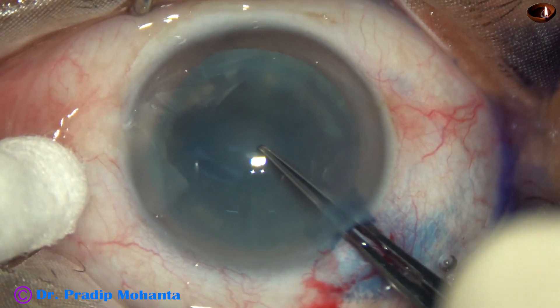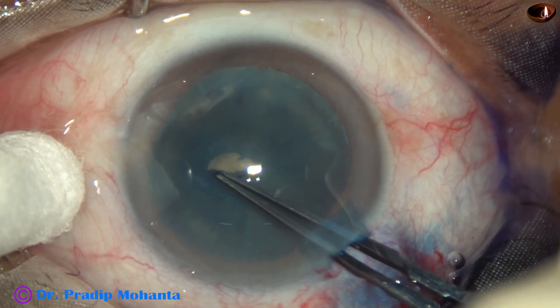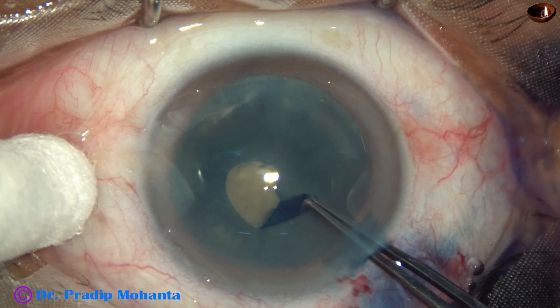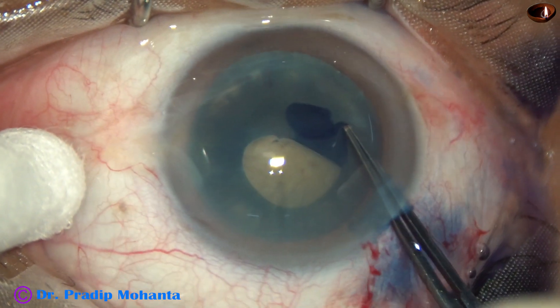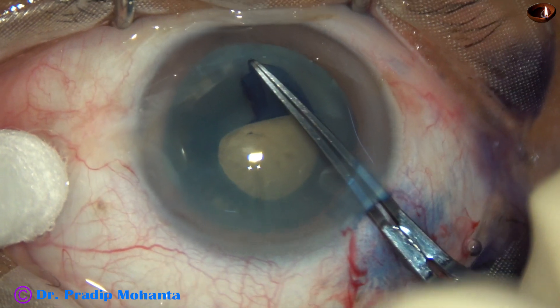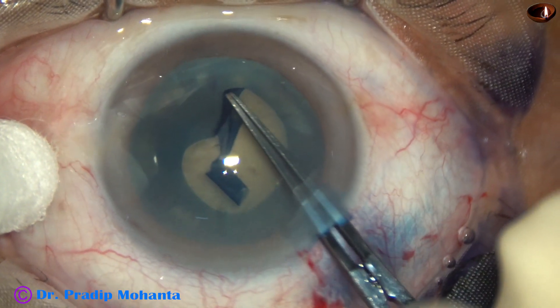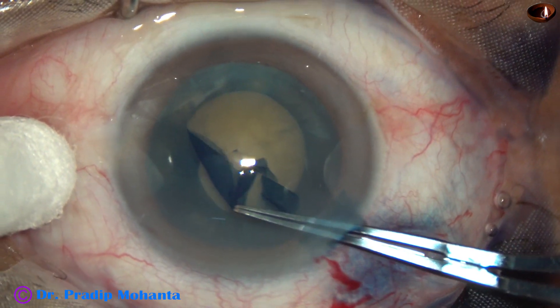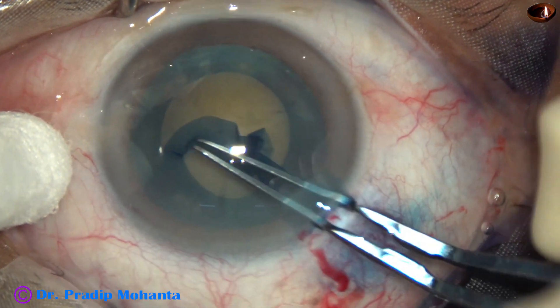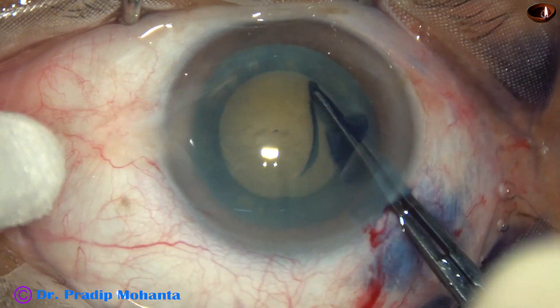And now watch the rhexis. When there is anterior insertion of the zonule, you can see that I am tearing off the zonular fibers. Because there is so much anterior insertion, I have to tear off some zonule to get an adequate size rhexis.